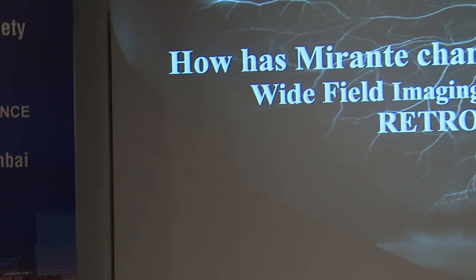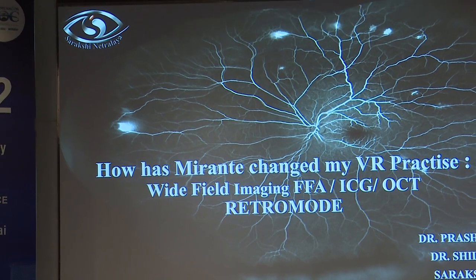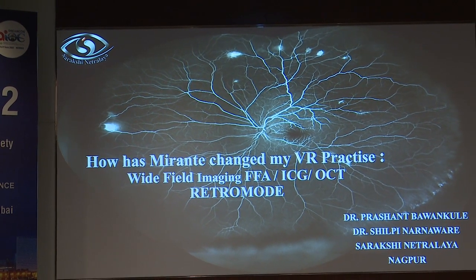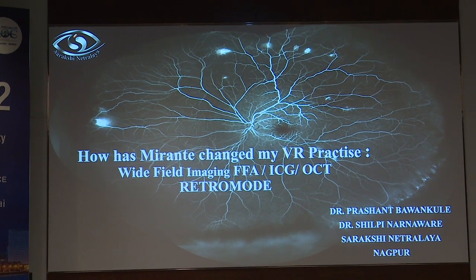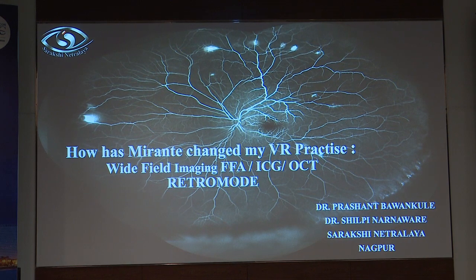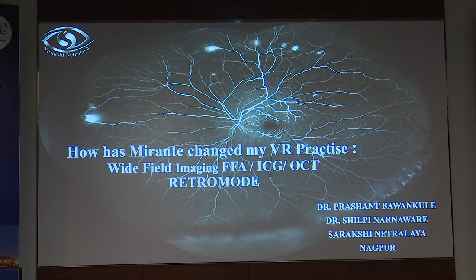Okay. So here I will be presenting a new technology, a wide field, ultra wide field angiography and imaging system. This is a multimodal imaging system. This is the advantage: we get not true colored images, but the advantage over other systems is that here they use 3 lasers, unlike Daytona or any other systems available, and therefore it's quite closer to true natural images.